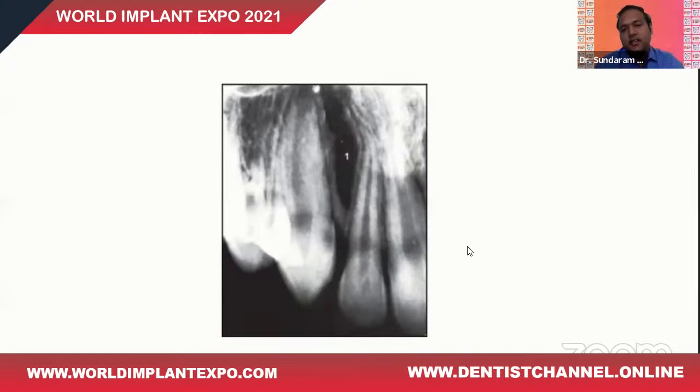This is another radiograph of the upper lateral and canine, which shows a bizarre radiolucent area in between. So what could this pathology be? This is nothing but the lateral fossa, which is not a pathology. So you get to see artifacts related to normal anatomy or anatomical variants. This could commonly be mistaken for pathology like a globulomaxillary cyst. Such uncertainties are always associated with two-dimensional radiographs.